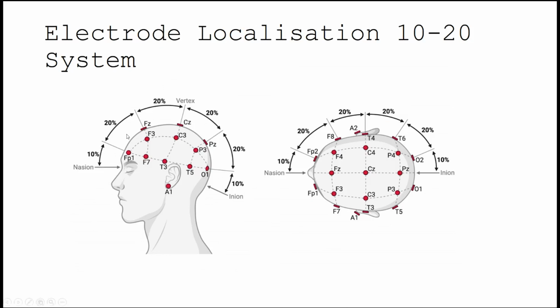And on the back, if you touch yourself, you're going to feel a small hill on the scalp. The most prominent point at the back of your head is called the inion. And then remember the name, the 10-20 system. For the first electrode, you move 10% of the head circumference. You remember the circle from geometry.